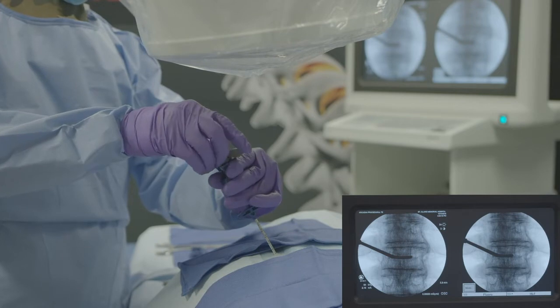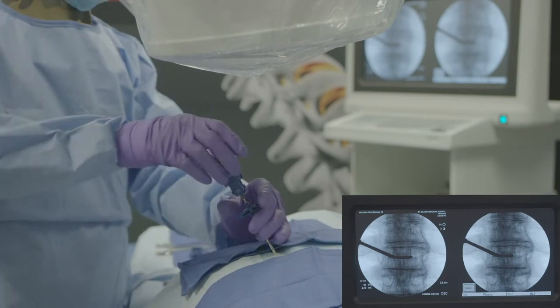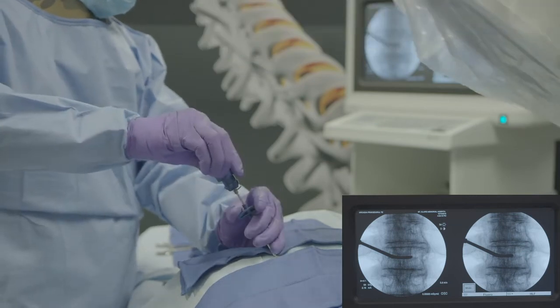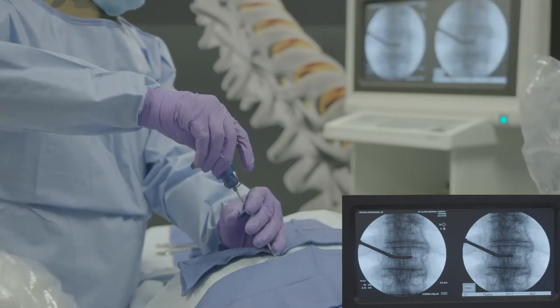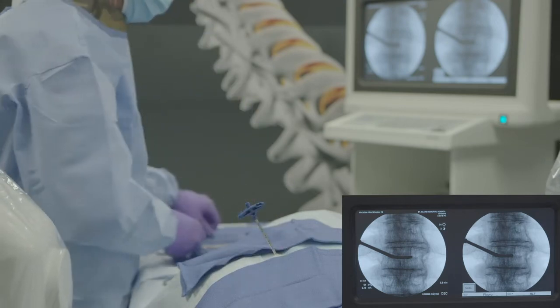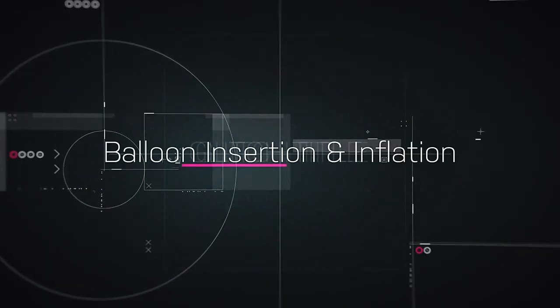Remove power curve navigating osteotome in the reverse order. Take care to alternate dearticulation and withdrawal. Verify under lateral fluoroscopic imaging that power curve navigating osteotome is clear of the anterior wall.